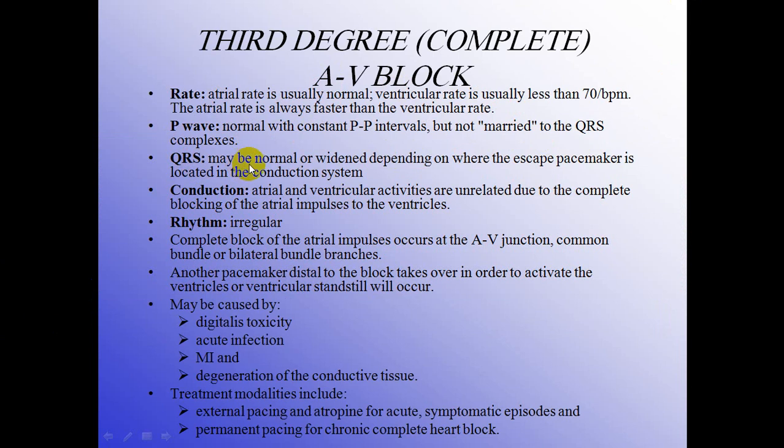The QRS may be normal or wide, depending on whether the escape pacemaker is located in the conduction system. Atrial and ventricular activities are unrelated due to the complete blocking of the atrial impulse to the ventricle.